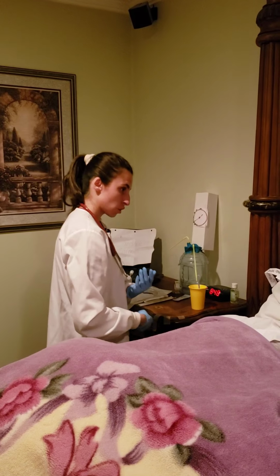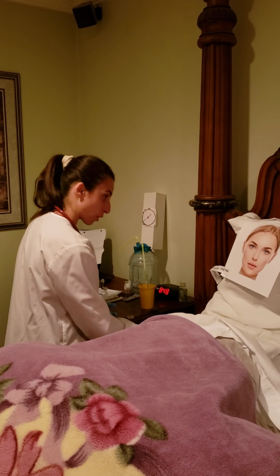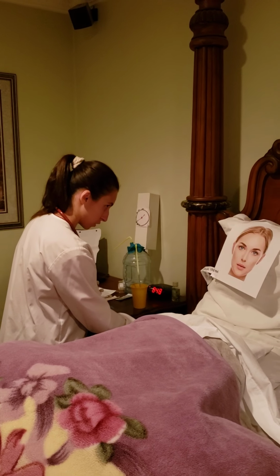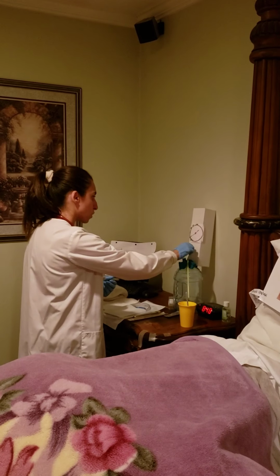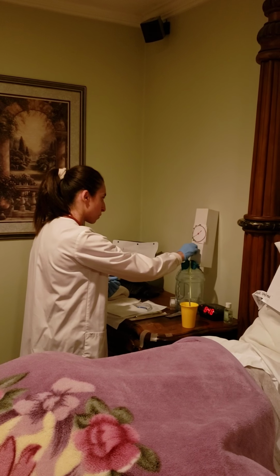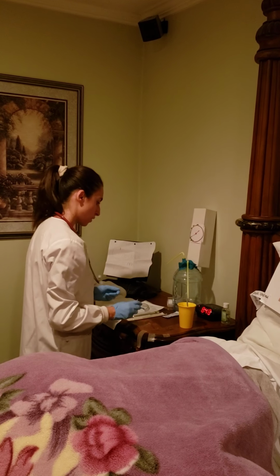And I'm going to raise your bed to working level. Raise level. And I'm also going to elevate the head of your bed also. So we're already here. Okay, now I'm going to turn the knob of the suction to about 30 to 40 millimeters of mercury. In this case scenario, I will do 40 millimeters of mercury.